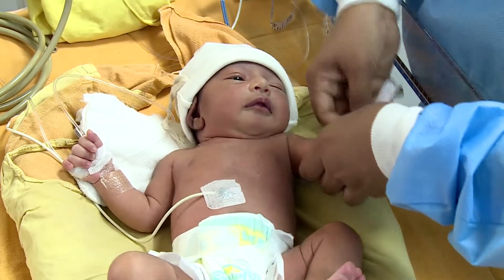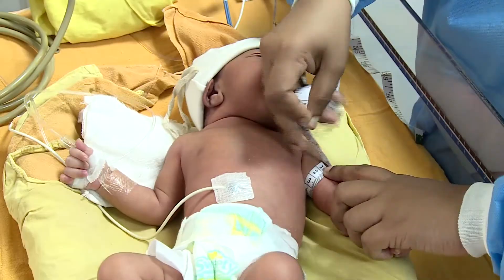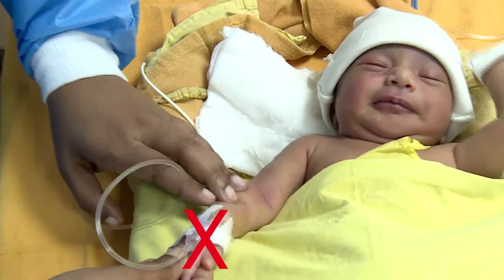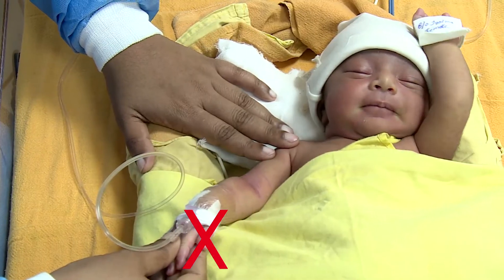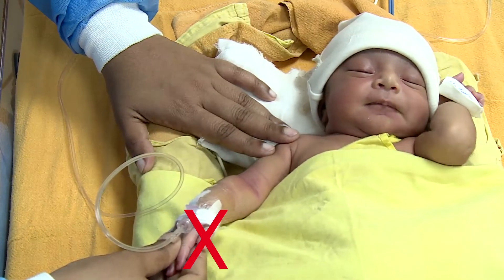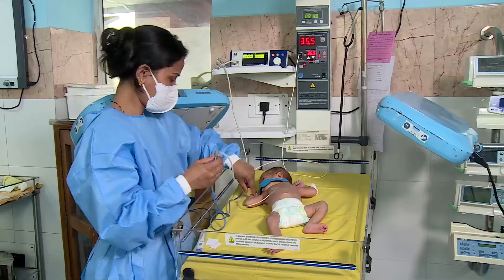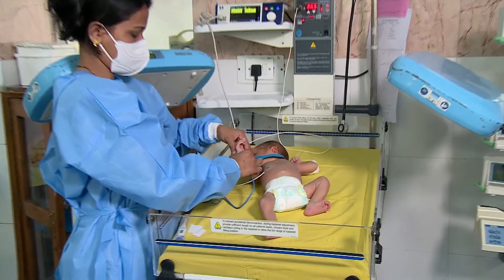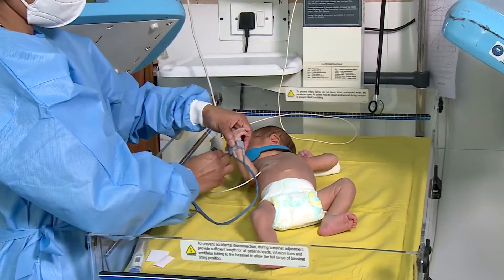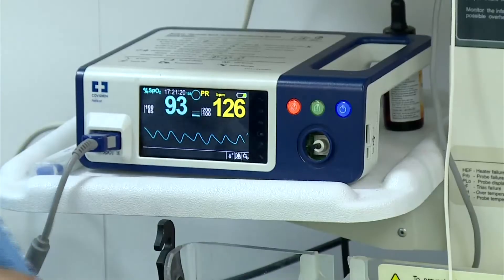The first step is selecting an appropriate site. Do not place the cuff on a limb being used for IV or intra-arterial infusions, or any area where circulation is potentially compromised. Use carefully when placing the cuff on an extremity being used to monitor other vital sign parameters such as pulse oximetry, which also uses a pulse for determination of values.